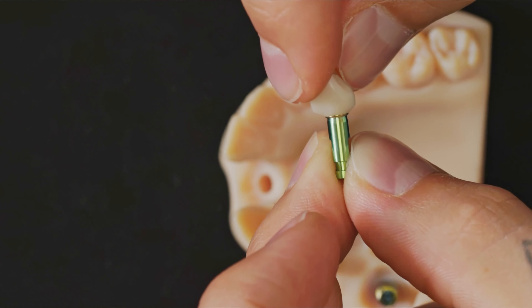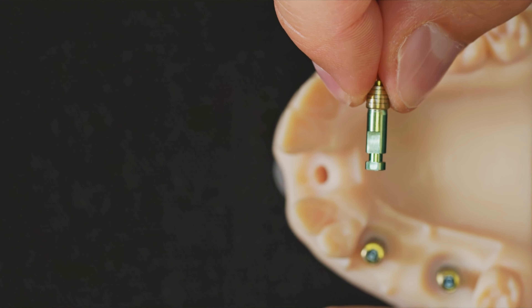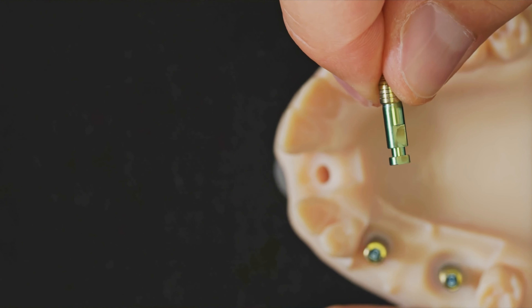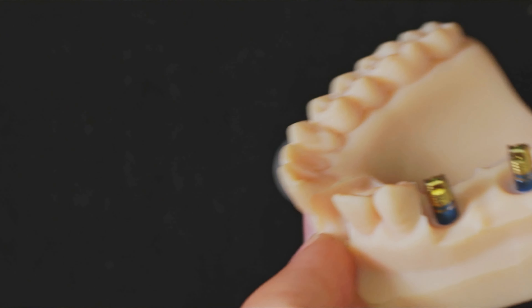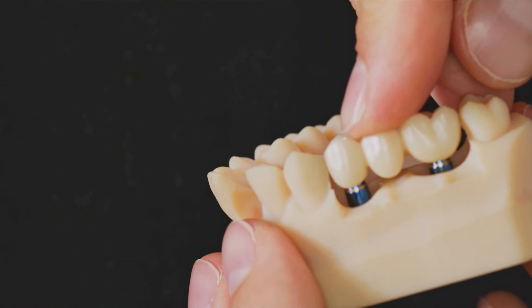The bridge fits very well because the implants are quite parallel. It was very easy to achieve this position in guided surgery. If the implants are not parallel, it might not be possible to close on the neck. Working on the model is very precise, as the analogs have large repositioning faces that allow you to find their innate position within the model.